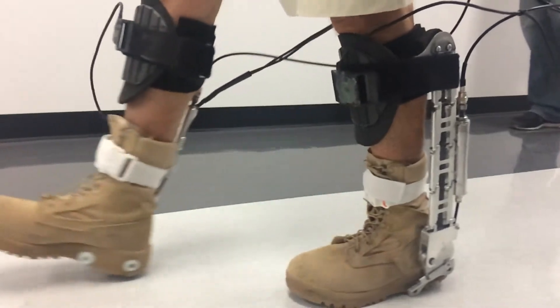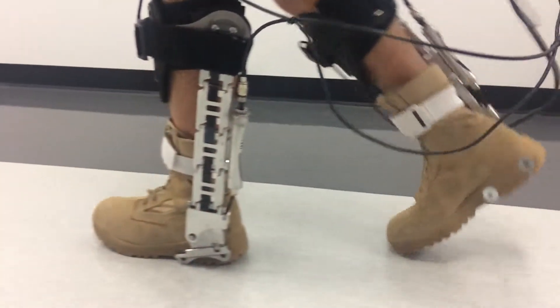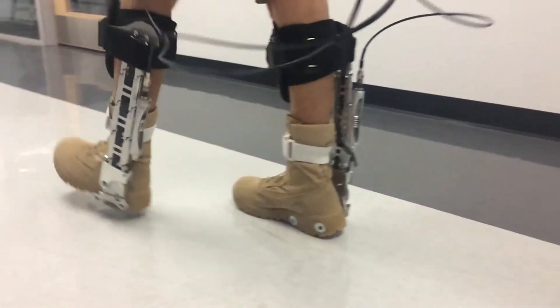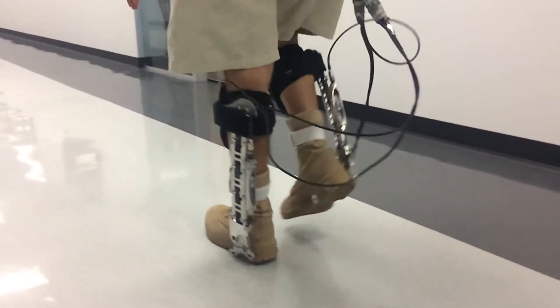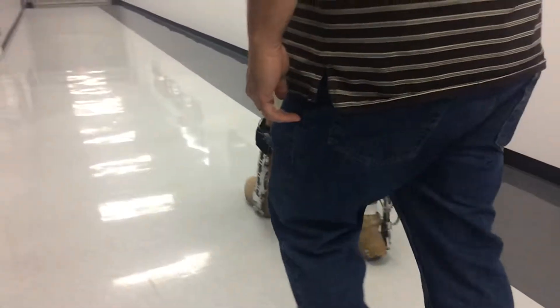We're hoping to continue to explore this and see if there's any utility in this for offloading patients or increasing patient stability. Patients who may have problems walking or weakness — maybe people who are still rehabilitating from a hip fracture — have a lot of possibility with this device.